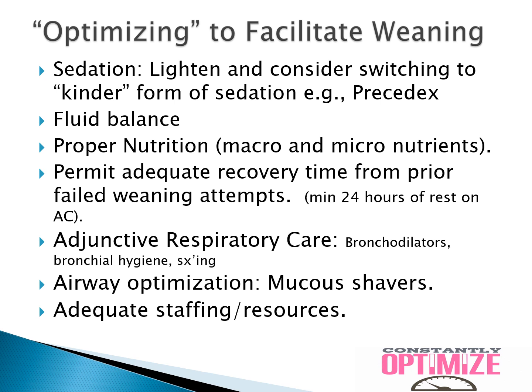Adjunctive respiratory care, so looking at things like bronchodilators, bronchial hygiene, suctioning, and things along those lines. There are some patients that, as soon as I extubate, and my colleagues extubate, if they sound like they have a lot of secretions right around where that cuff was, we'll just go down and nasotracheal suction them. When I say right away, I mean once the tube is out and their SATs are okay and things along those lines. And then looking at airway optimization using mucus shavers or wiper caths, and we'll talk a little bit about those.